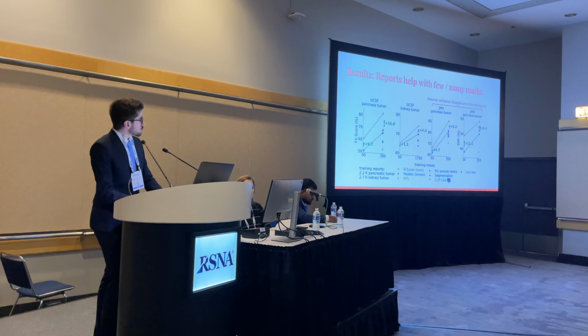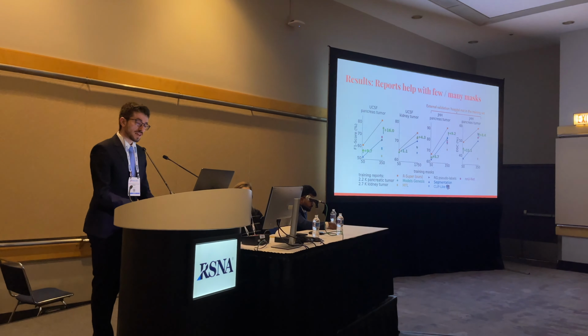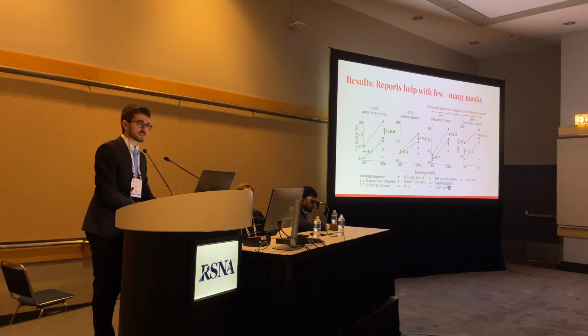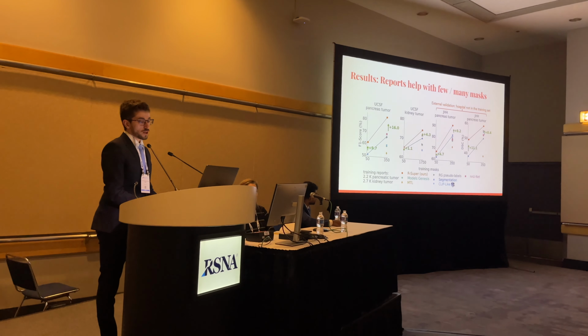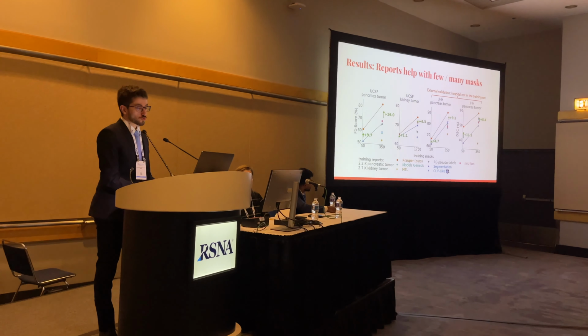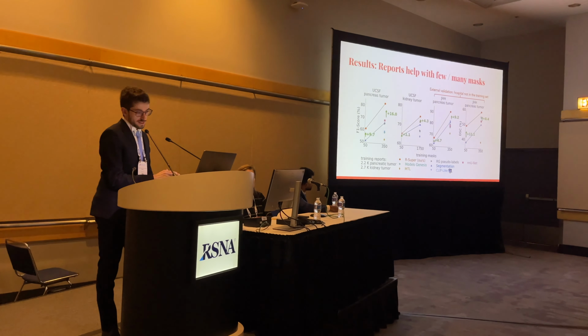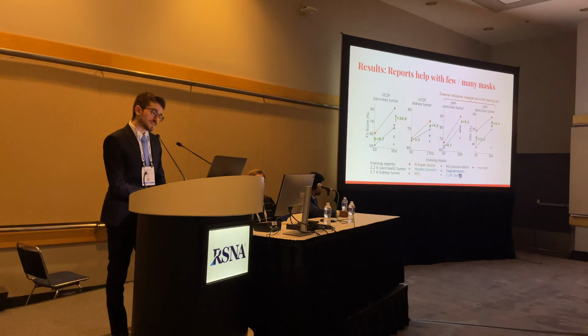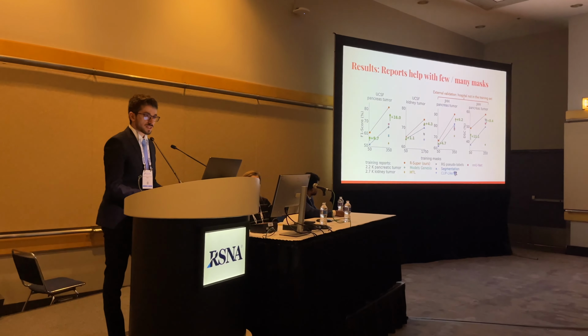Another very important result: no matter if you have few masks or many masks, if you add reports to your data set, you have much to gain. So here, for example, if we train with 50 pancreatic tumor segmentation masks and we add 2,000 reports, we gain 11% dice in external validation. If you have 350 and you add the 2,000 reports, you gain 8% dice.